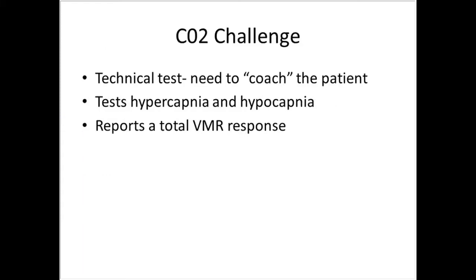So the CO2 challenge test is pretty technical. You do need to coach your patient throughout the exam, especially when they're breathing in that CO2. They've got a nose clip on their nose, which could be pretty uncomfortable. They're breathing in this gas mixture and it tastes dry. And because it's a high percentage of CO2, their brain is saying, I'm not getting enough oxygen.